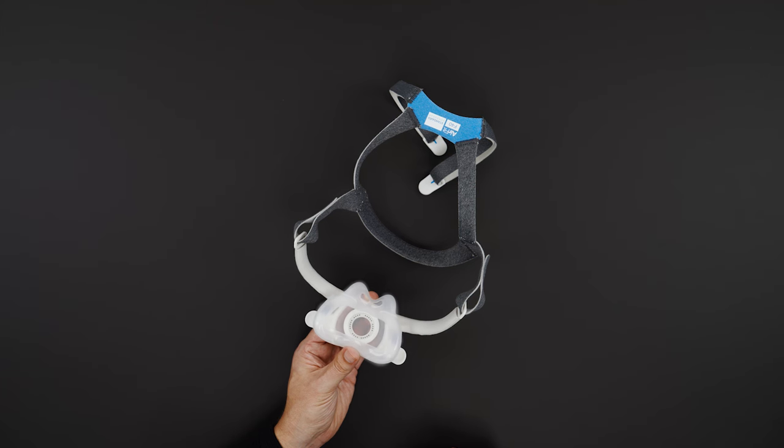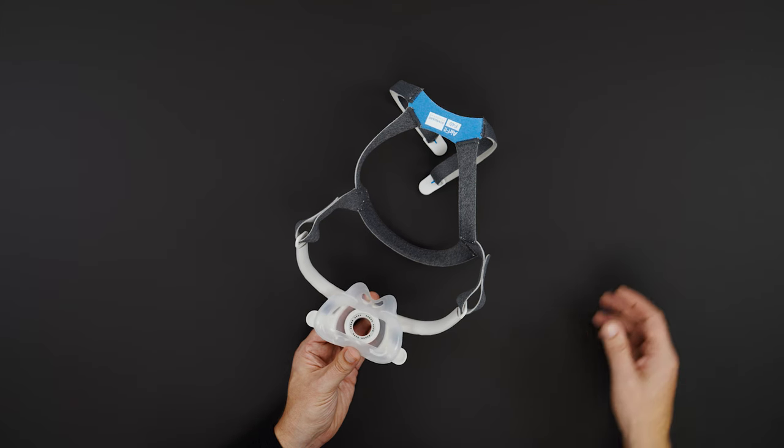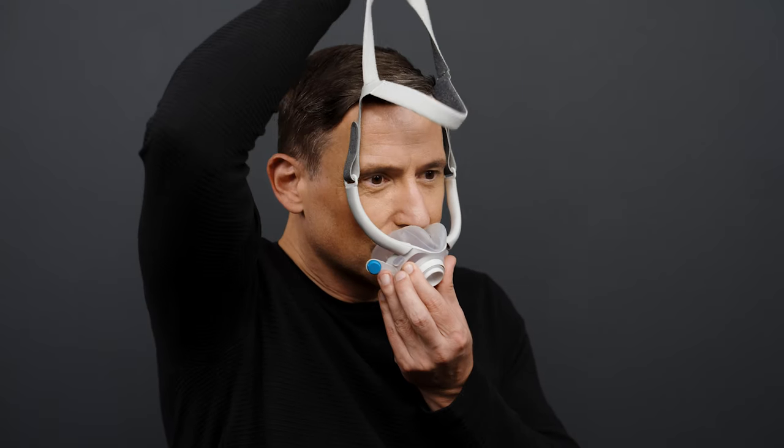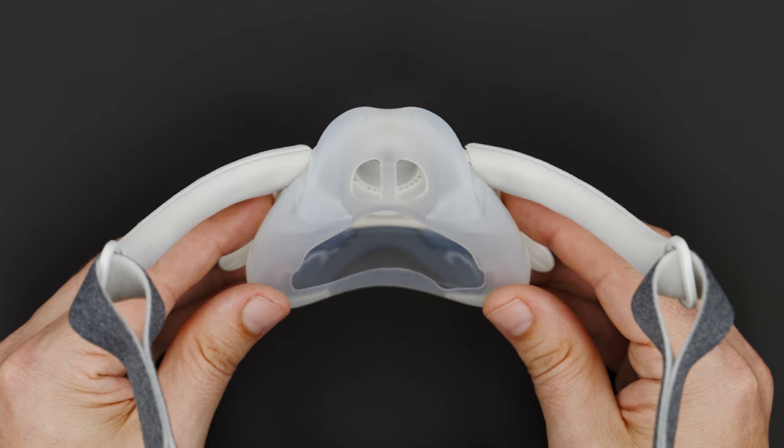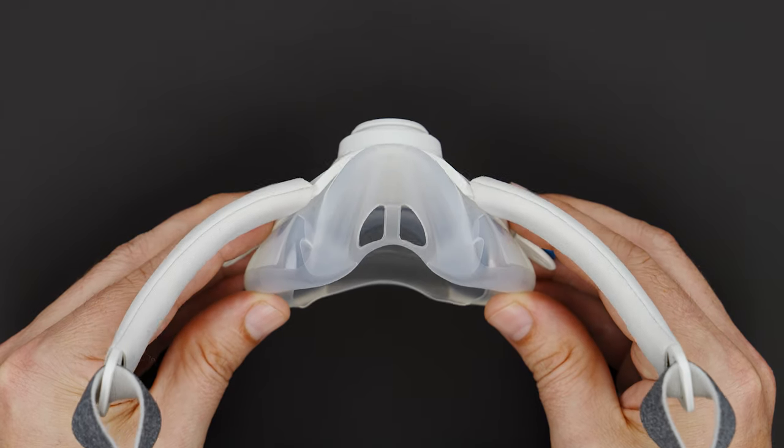Place one hand on the cushion and one hand on the back of the headgear with the ResMed logo facing out. Place the cushion under your nose and pull the headgear over your head. Make sure the cushion sits comfortably under your nose so your nostrils cover both holes in the cushion.